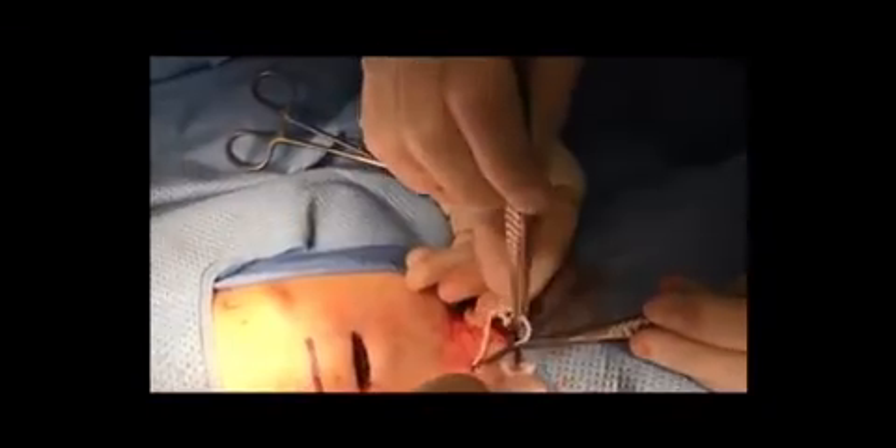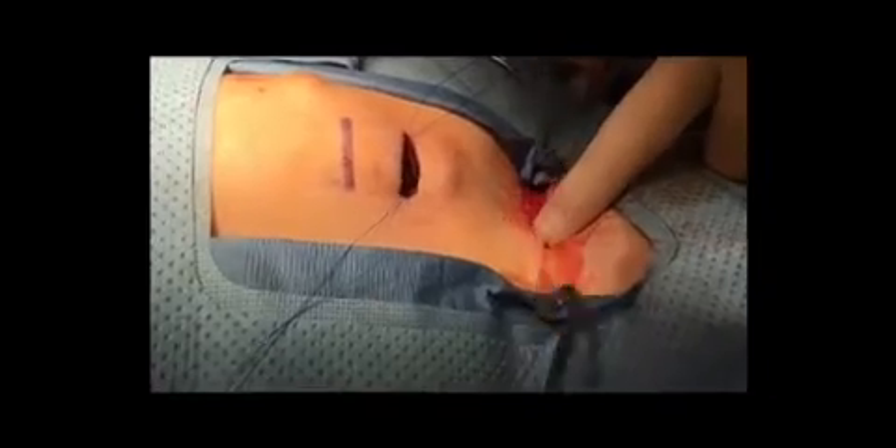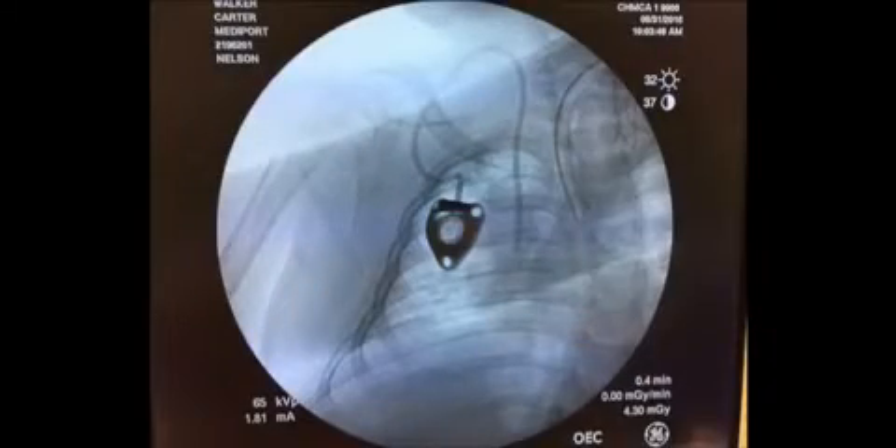The catheter is then passed into the dilating sheath. The port is accessed to make sure that it flushes and aspirates well, and then fluoroscopy is used to make sure that the catheter tip is in the precise location.